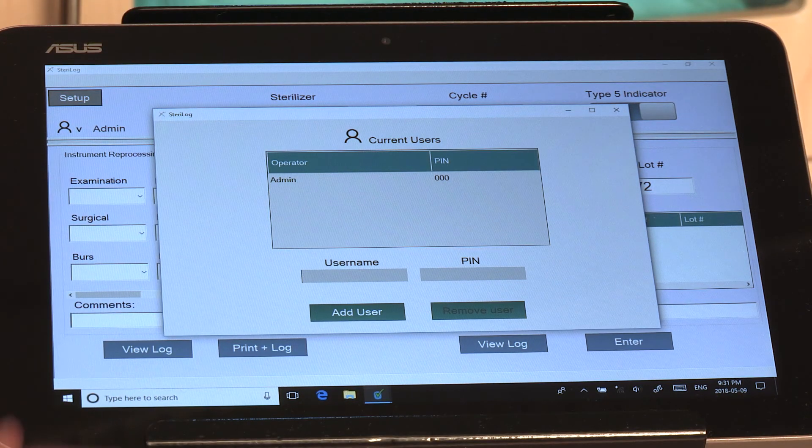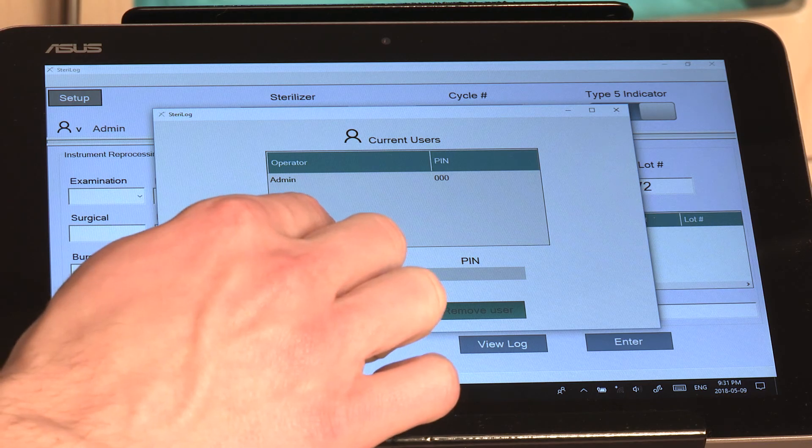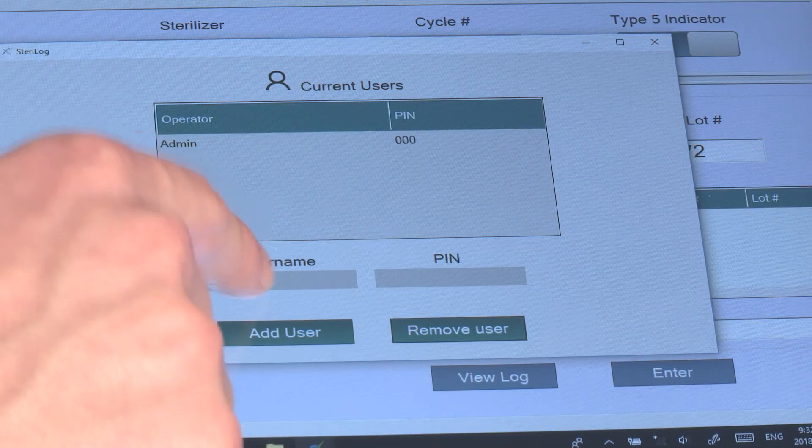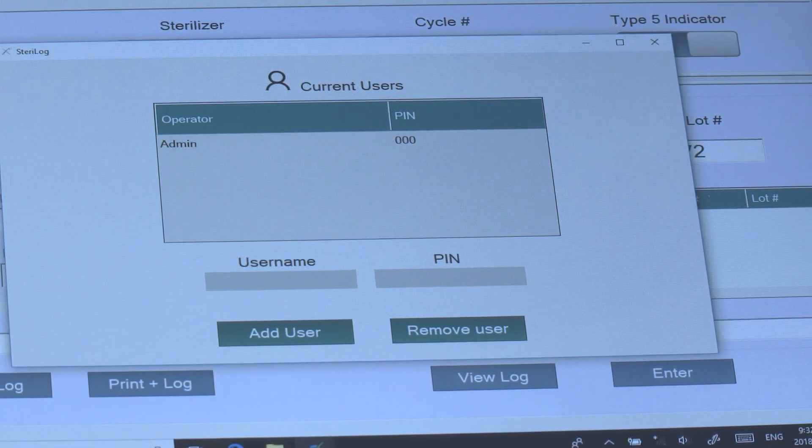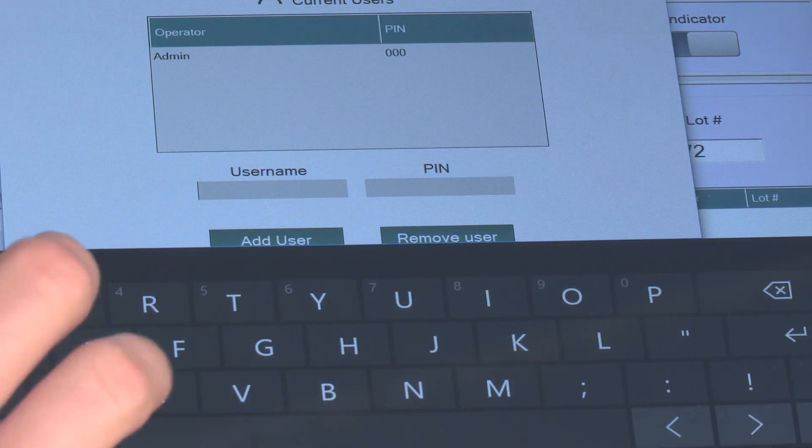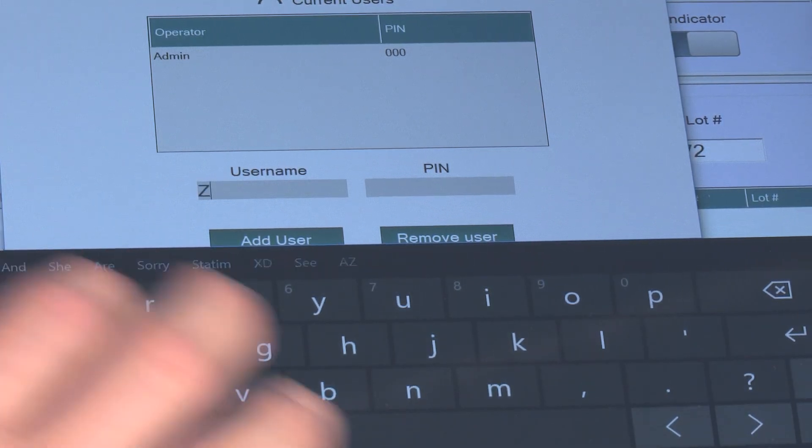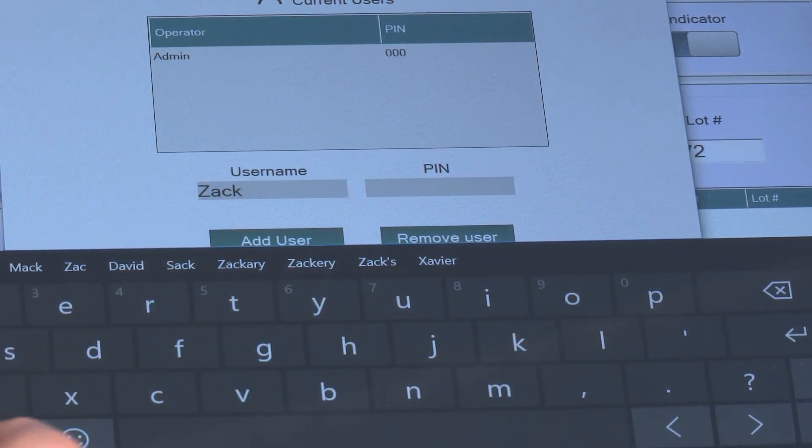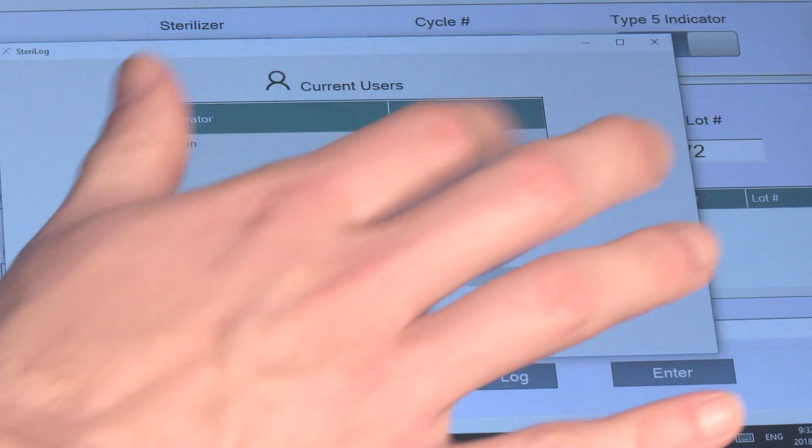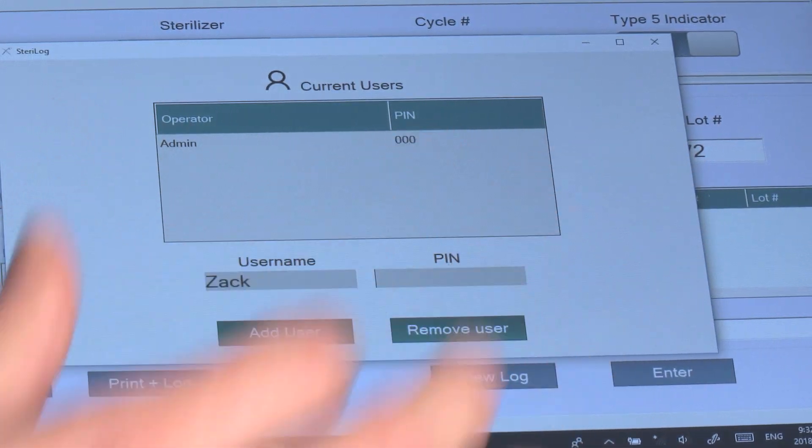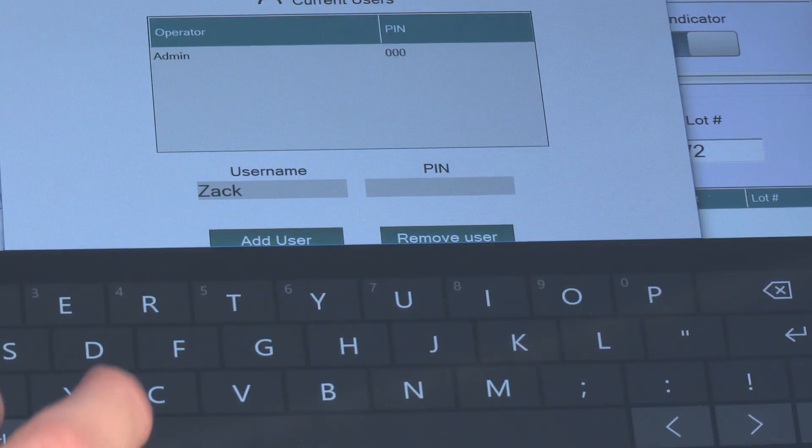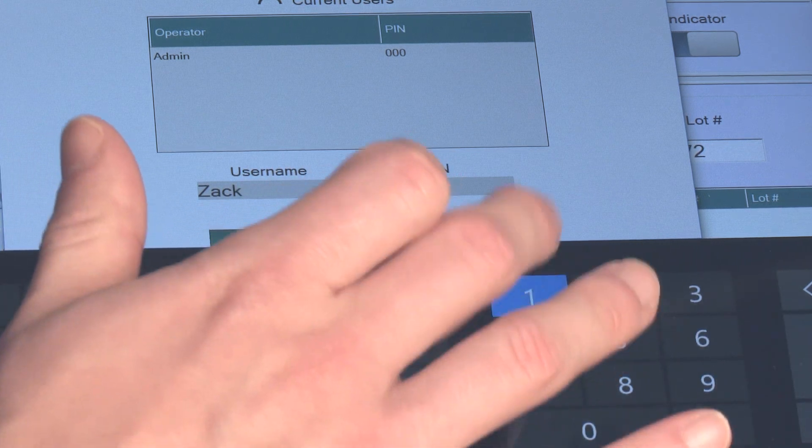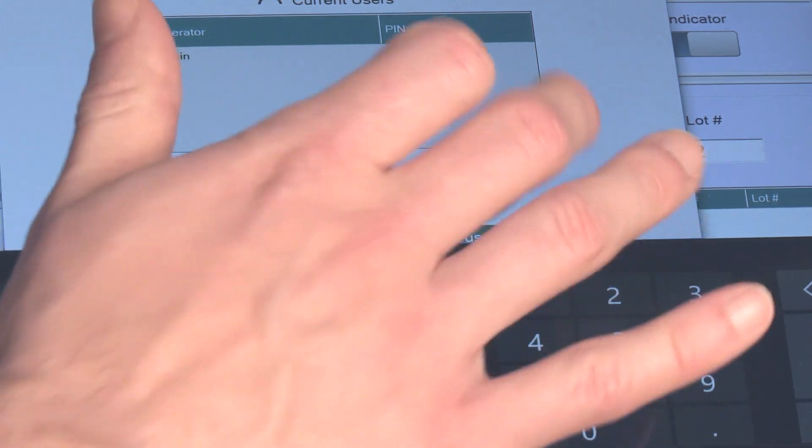So you'll start by entering your usernames. In this case we'll use Zach and we'll choose a PIN, so we'll enter the PIN field, let's say 1-1-1, and hit Add User.